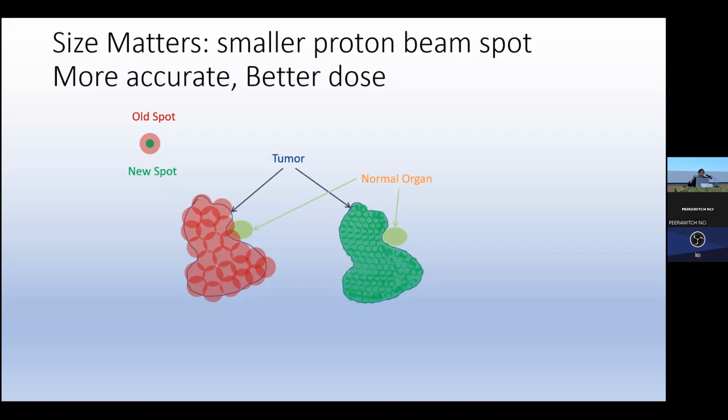When you do that, you get a lot of mixture, right? There's a lot of things coming out of there. I'm going to say it's kind of a dirty beam that comes out. And then you saw in the traditional system, you have this bend. Well, that bend is actually the energy selection system. After you go through this degrader, you go from 250 to 100, but you have 100 plus or minus like 7. So you have this big beam, also spread out in depth. You just went through all these things. You no longer have a focused beam.